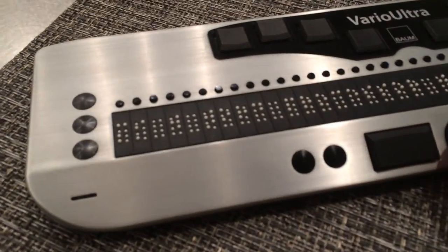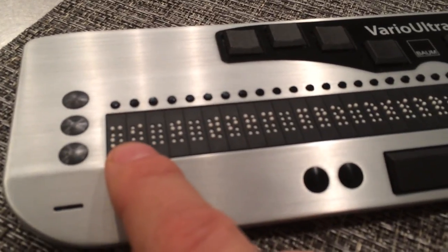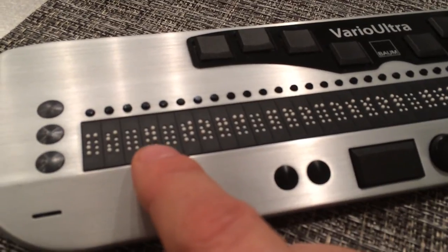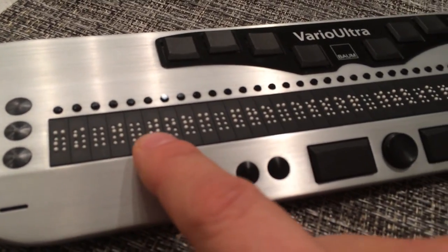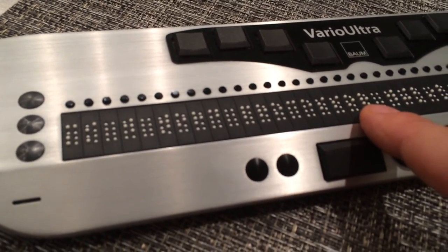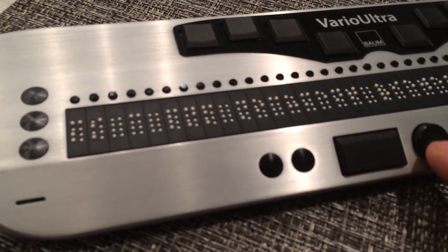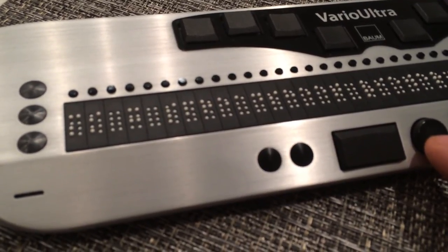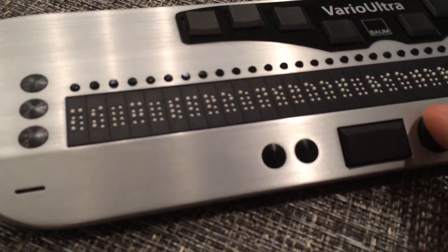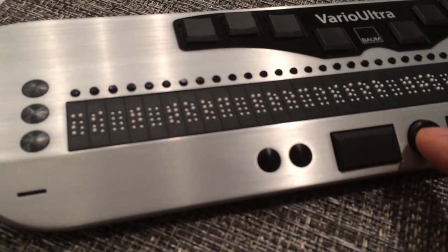Right now we're actually in note-taker mode. On the Braille display, we'll always see MI for menu item. We'll then see the mnemonic — in this case, W for word processor — and then we have word processor displayed in Braille on the display. If I go down the list, the Braille display changes. We next have our PDF document viewer, then our Excel spreadsheet viewer, and so on. Anytime I am on an item — for example, word processor — if this is what I want, there are a number of ways I can get into it.